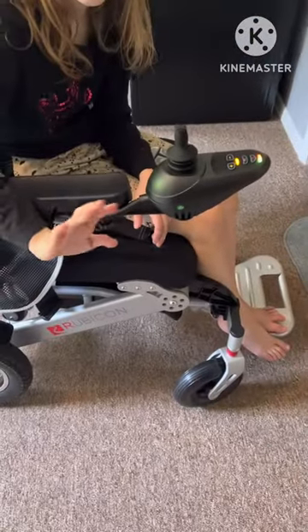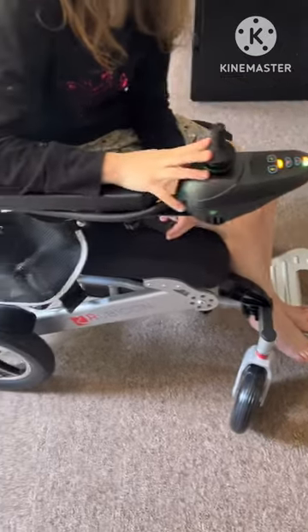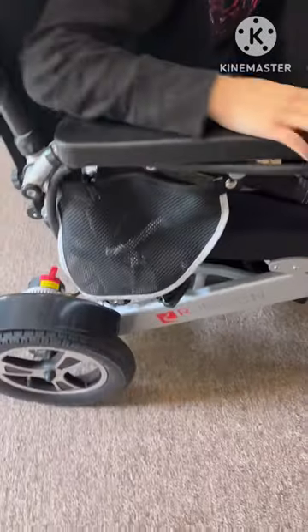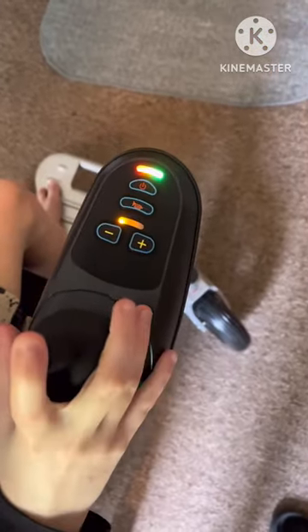Here's how to disable the backup horn button sound that will drive you insane with this Rubicon wheelchair — this is the DX14, also called the BC-EA8000. Push the horn button and the positive button at the same time.